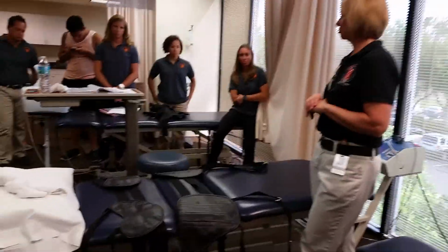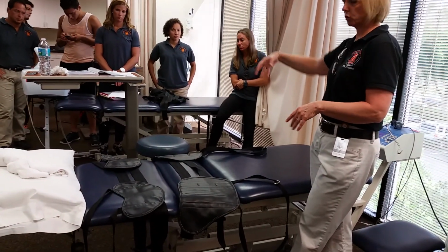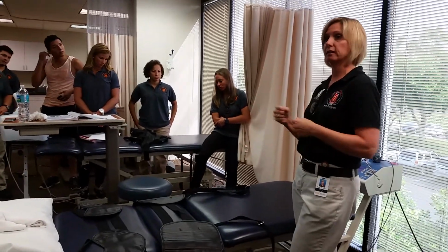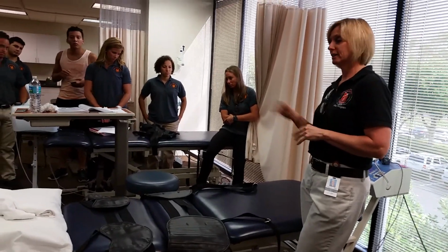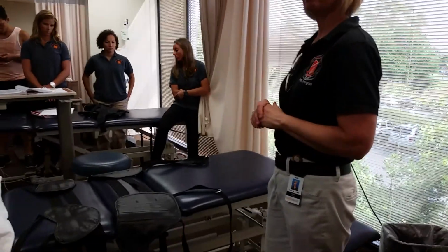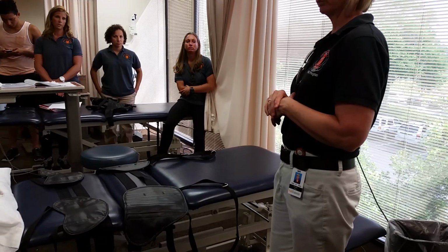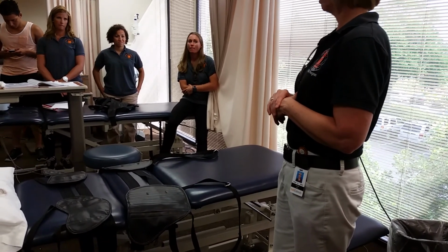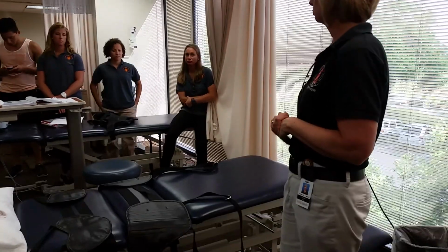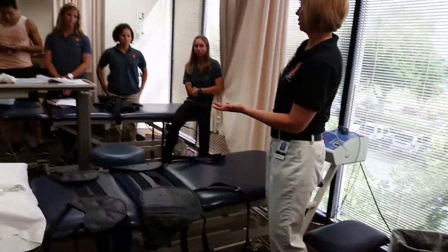Any questions on traction? There is another set of traction pads that you can practice lumbar setup on, because you need to practice that, believe it or not. That's actually the hardest part of this, is putting on those pads. So that's going to take you the longest time, and that's what you need to practice. Yeah, absolutely. Then you get a little alcohol wipe and you wipe them down. Because they're going to make you sweat. That's what the point is, attached to the skin.